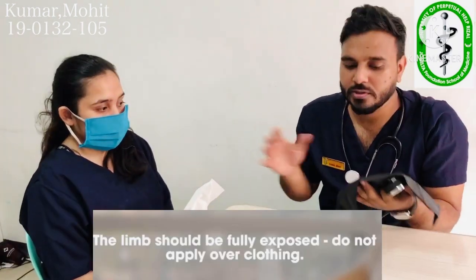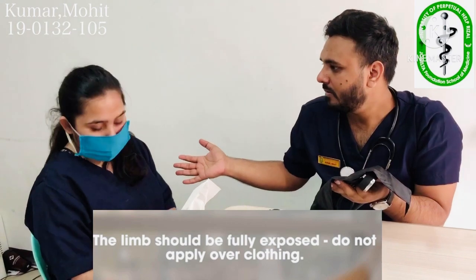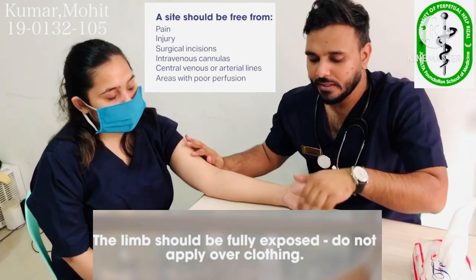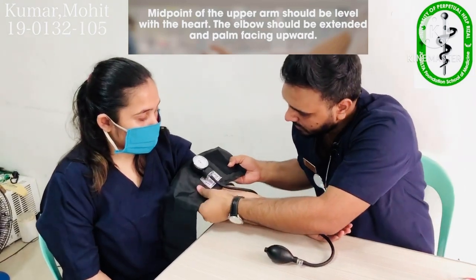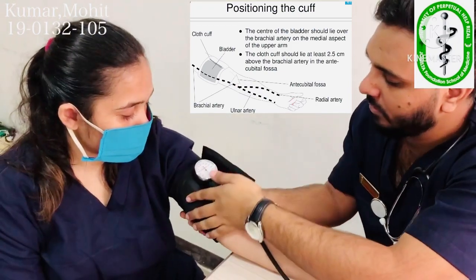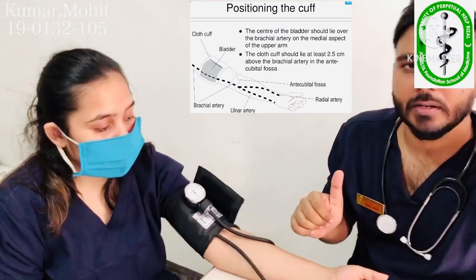This is my cuff. First, we should not put the cuff on clothing — we need to expose the arm. Will you please expose your arm? Here we have the patient's exposed arm. We put the cuff over here, making sure it is not too tight or too loose. We close it and insert two fingers to check fit — now it is on a proper place.